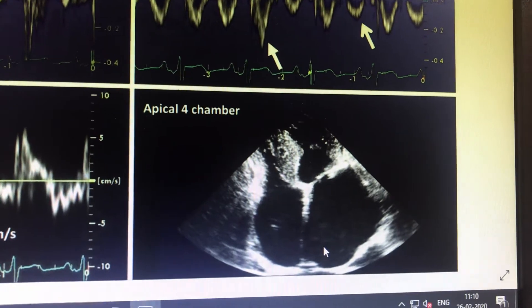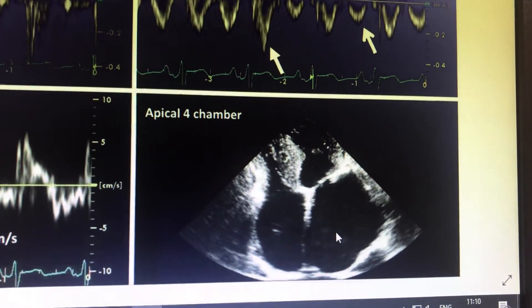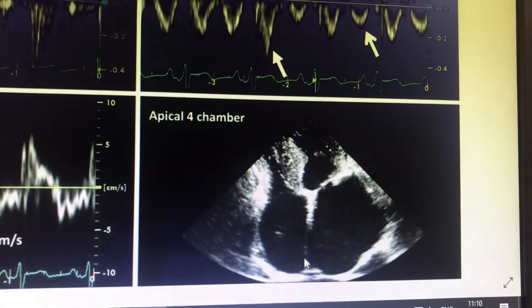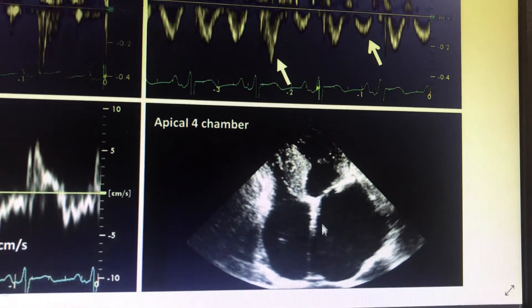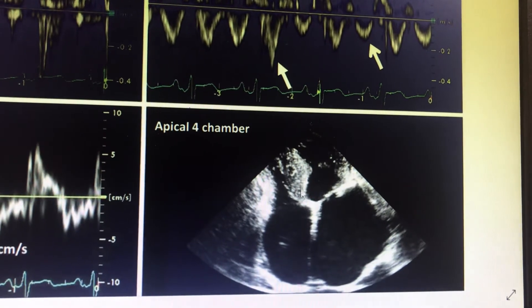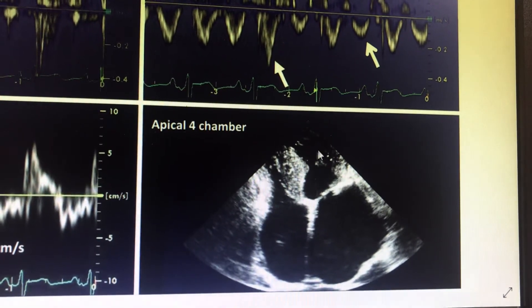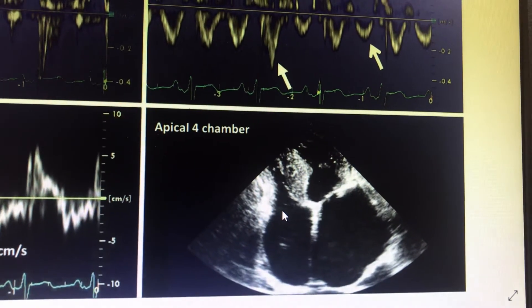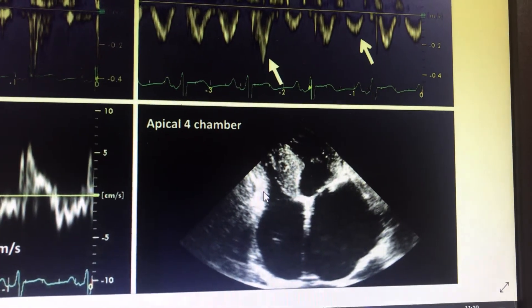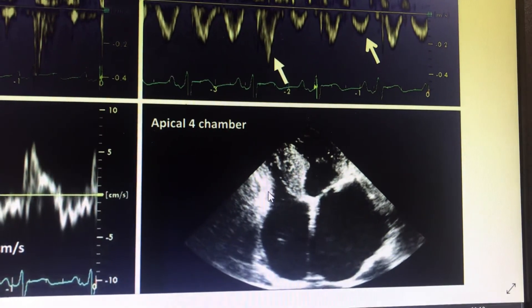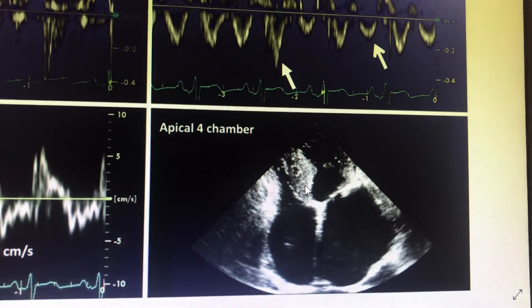For secondary restrictive cardiomyopathy like amyloidosis, there are classic 2D echo findings. There will be an 'all side' appearance with biatrial enlargement. The interatrial septum (IAS) will be thickened. There will be thickened valves and a pattern of thickened septum with fibrosis in between. LVH may be present, though hypertension and HCM need to be ruled out. Hyperechogenic valves will be seen due to amyloid deposition, though these findings are less well-defined and can be seen in other conditions.